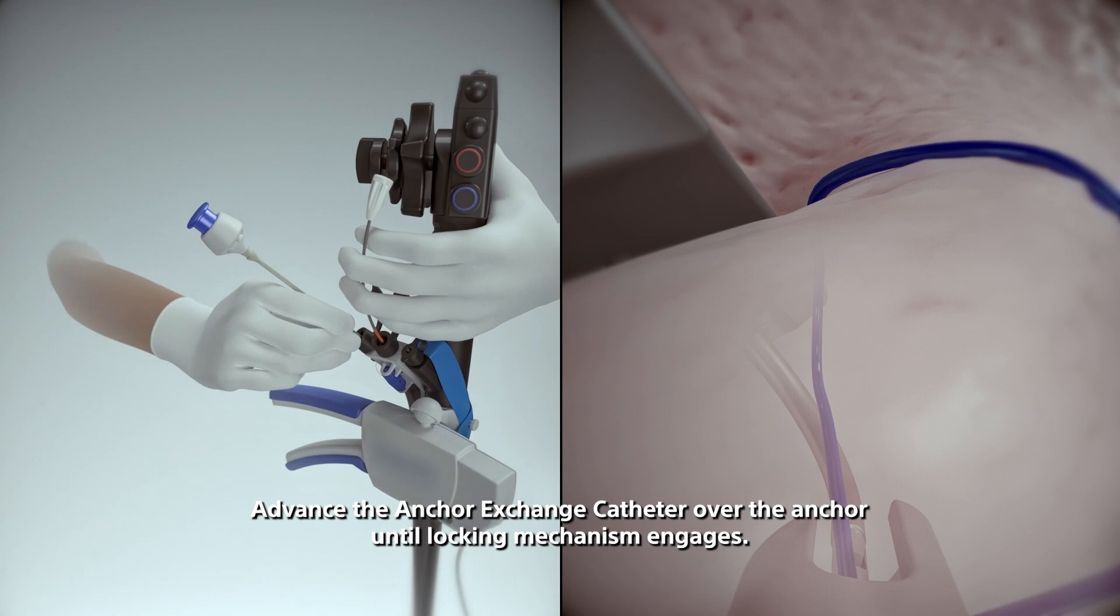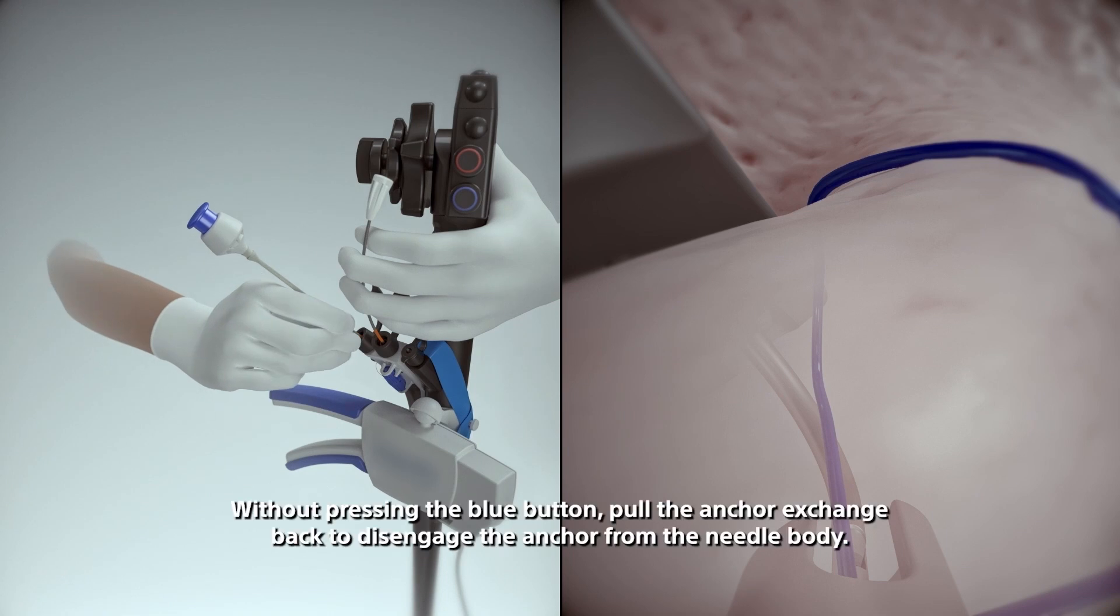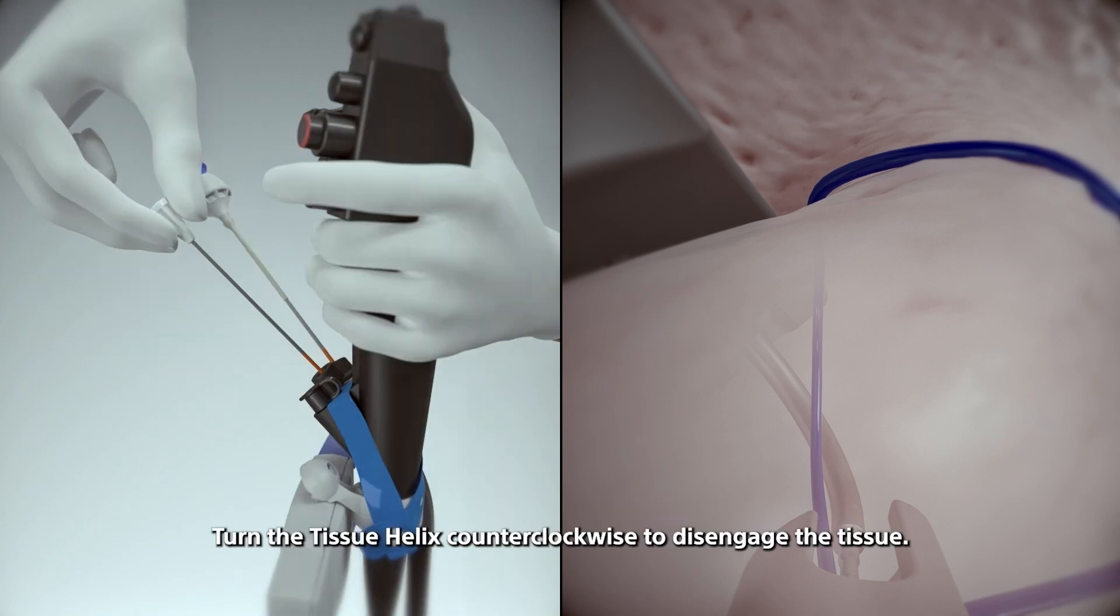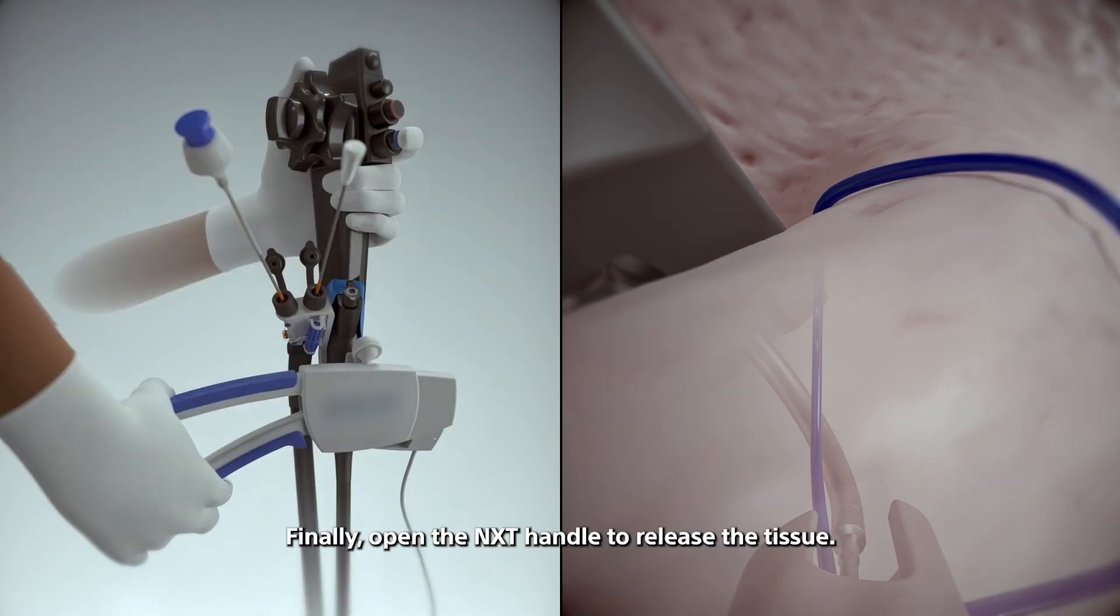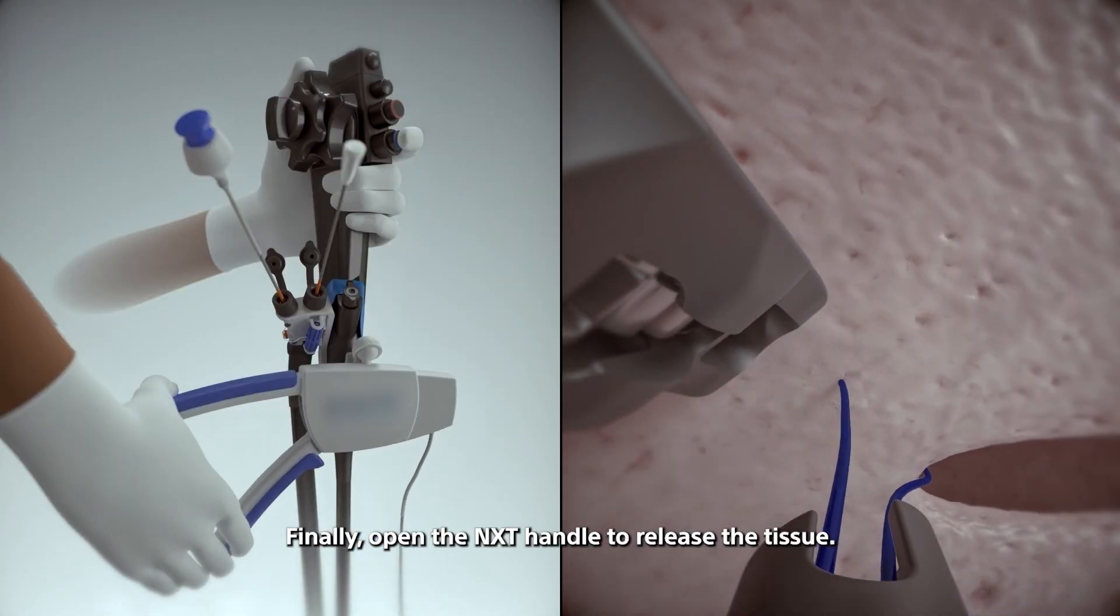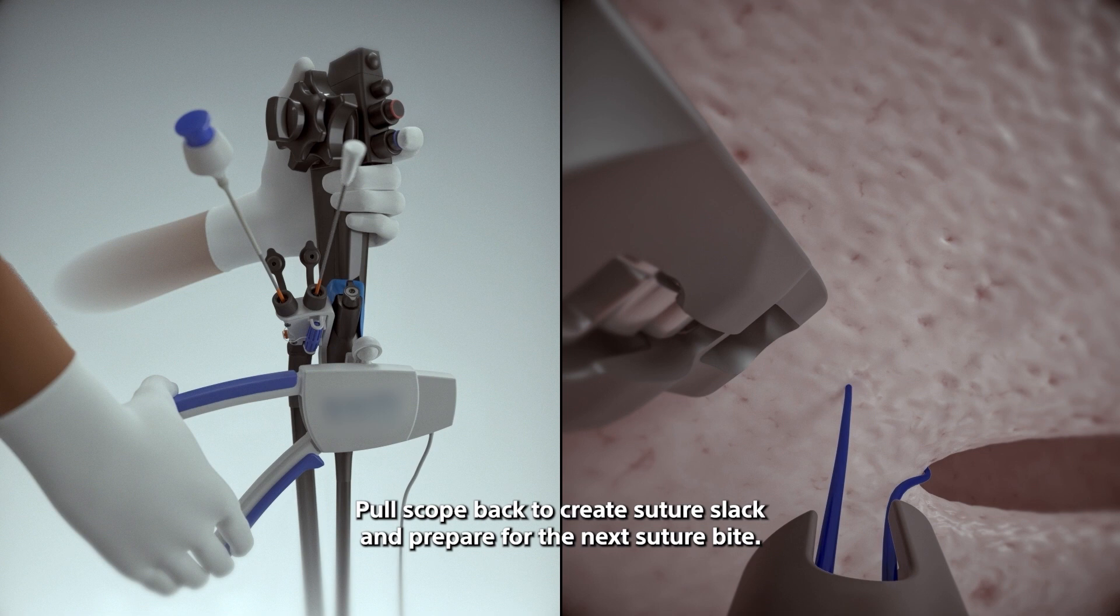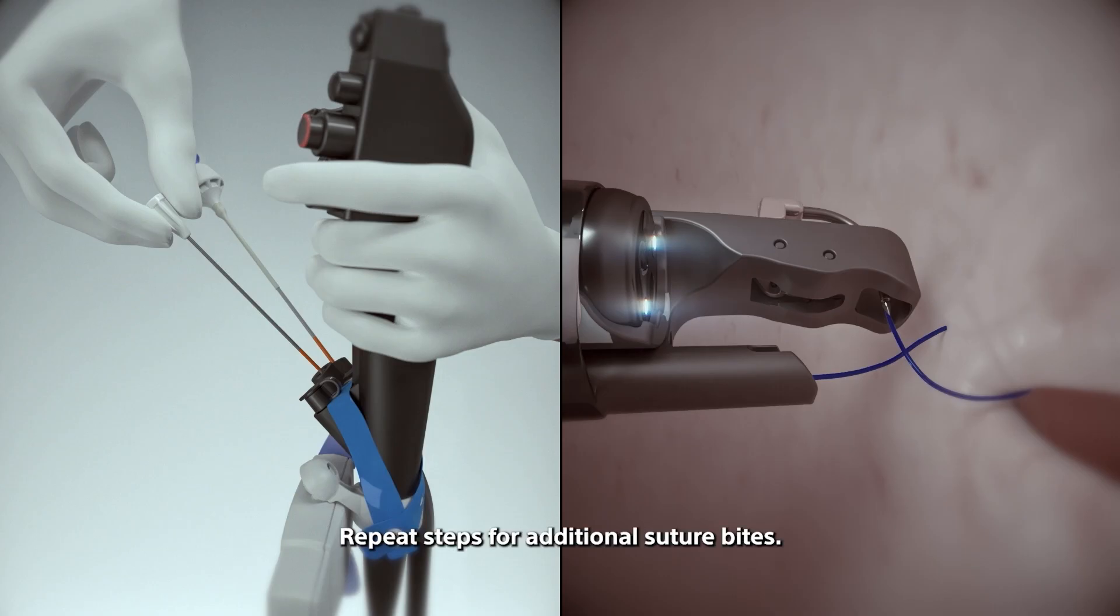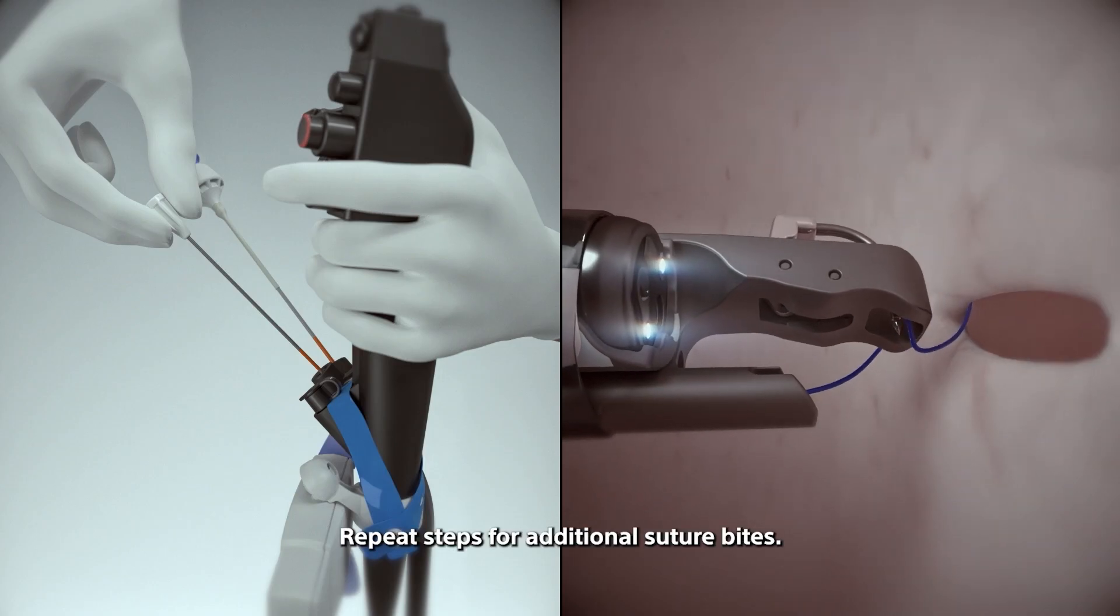Advance the anchor exchange catheter over the anchor until locking mechanism engages. Without pressing the blue button, pull the anchor exchange back to disengage the anchor from the needle body. Turn the tissue helix counterclockwise to disengage the tissue. Finally, open the NXT handle to release the tissue. Pull scope back to create suture slack and prepare for the next suture bite. Repeat steps for additional suture bites.